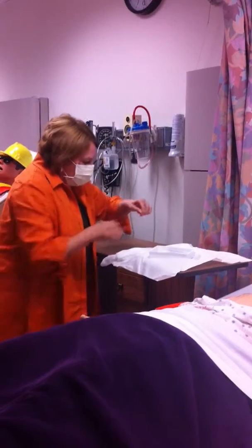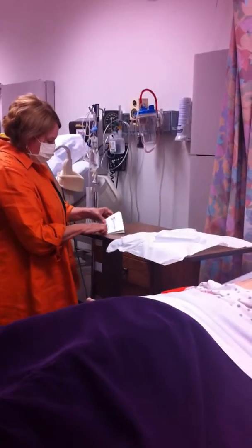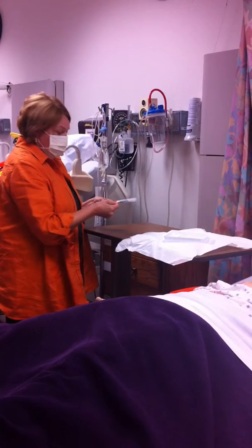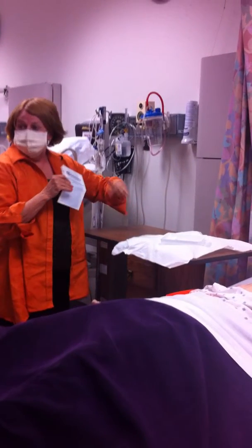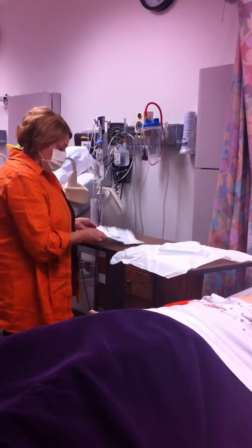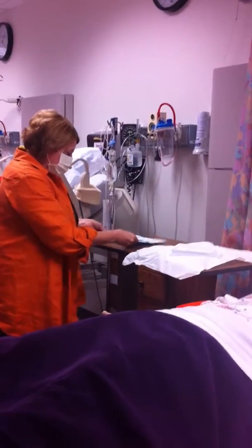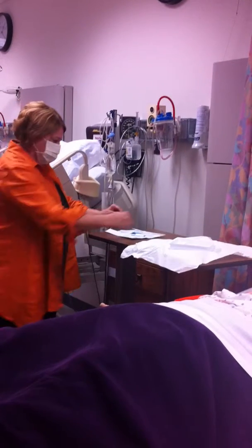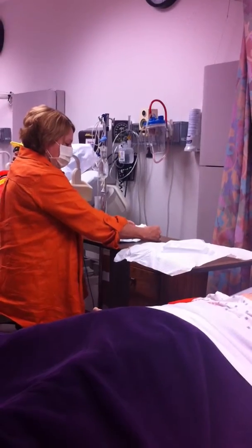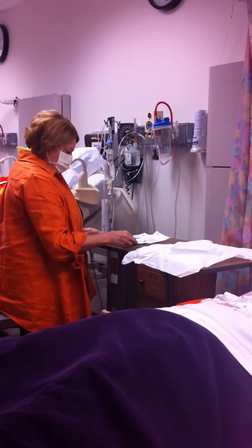Okay, gloves. See what we got here. These are mediums. They're going to be way big for me, but I can still do it. Sterile touching non-sterile, non-sterile. You don't have to be afraid of the package the way you were when you very first learned how to do this. When you were afraid of the package? Okay. Following the ABCs, away. Make sure you get that little crease pressed down so that it doesn't flip back. Below.